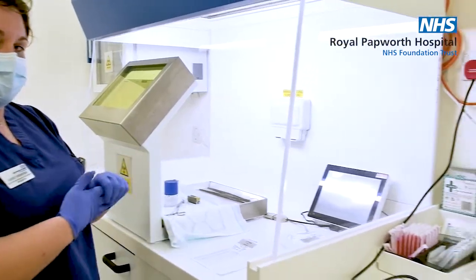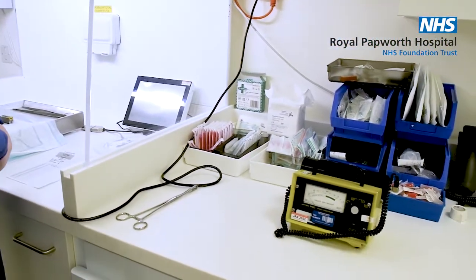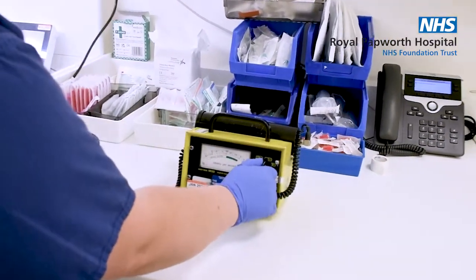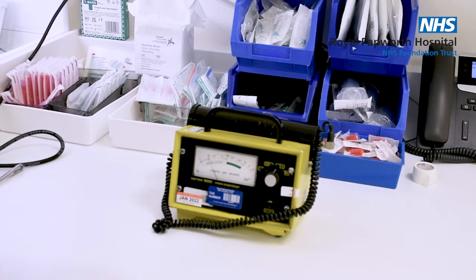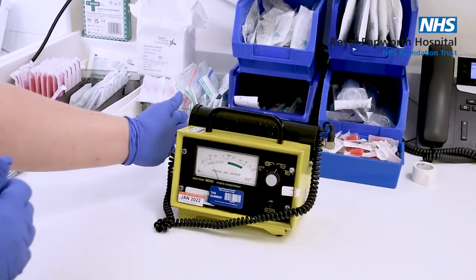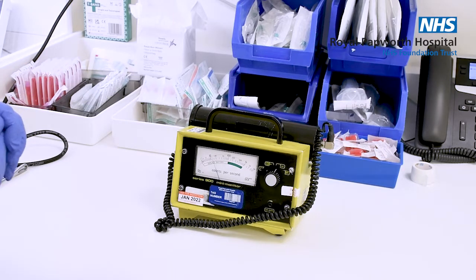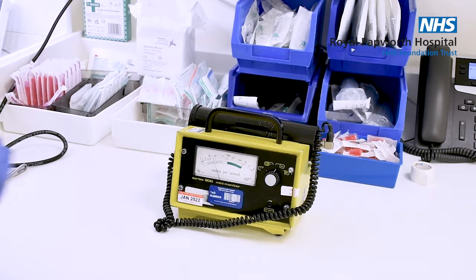We have a monitor right here which is called a mini scintillation monitor. It will make a little clicking sound as I turn it on. We can then put our hands in front of it to make sure it's not detecting anything. It measures in counts per second — anywhere between 10 and 20 counts per second is background radiation, and anything above that would indicate radioactive contamination.